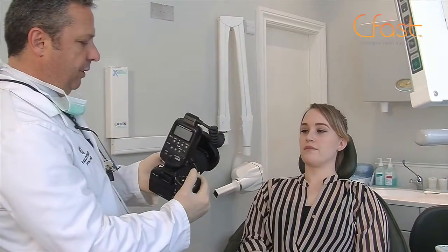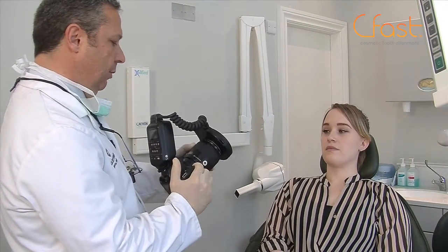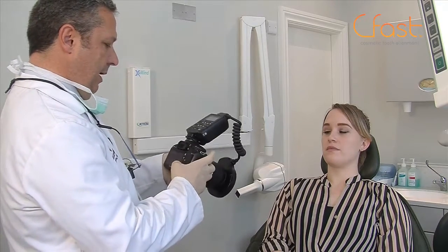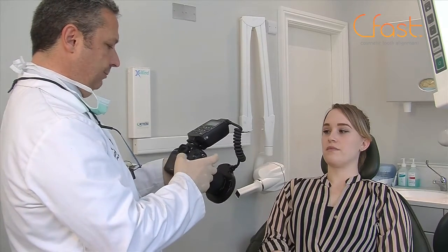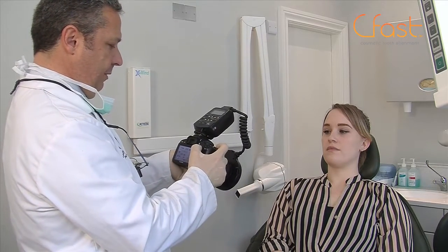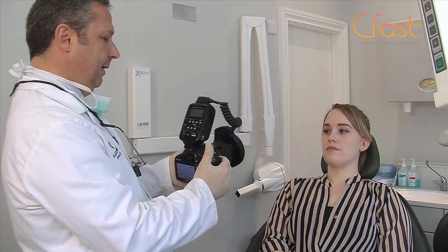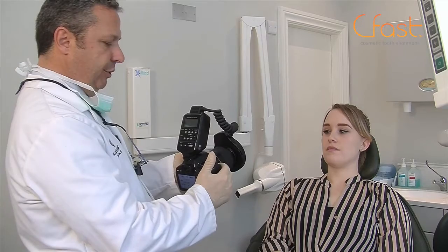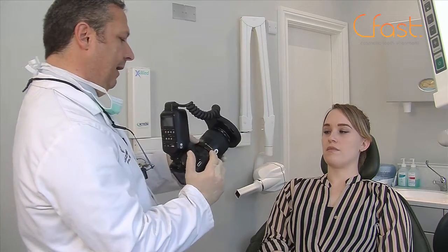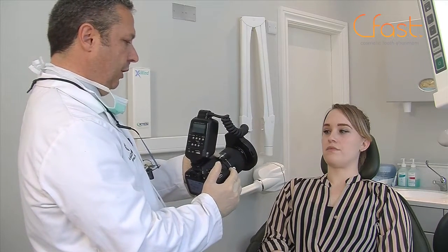And the changes we're going to make on the camera is we're going to take it off automatic focus. We're going to put it on manual. We're going to put our setting for our 1 to 2 view. So we're going to have it on 3, and we're going to have our aperture on f/22. And from here on in, I do not need to change anything except this dial for when we're doing a close-up. Everything else is set up. f/22 and 3 to get a 1 to 2 shot, okay? So now we're going to go and take our photos.